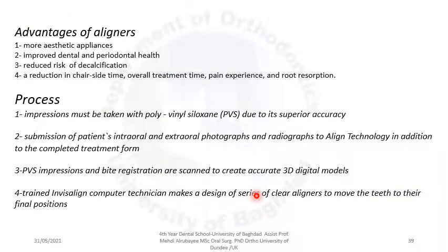Advantages of aligners. First, a more aesthetic appliance, improved dental and periodontal health, reduced risk of decalcification, and a reduction in chairside time, overall treatment time, pain experience, and root resorption.